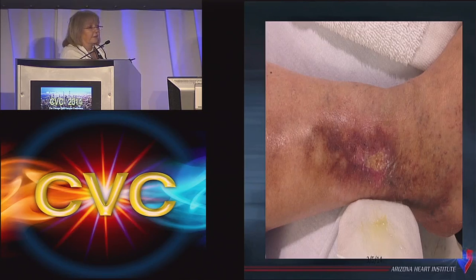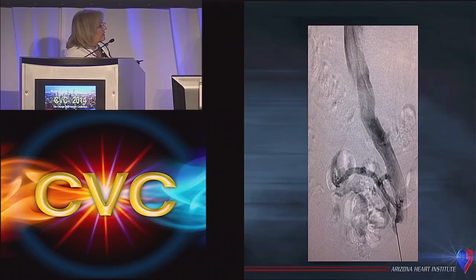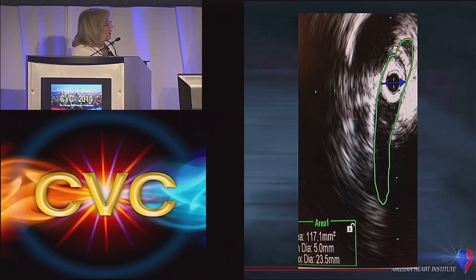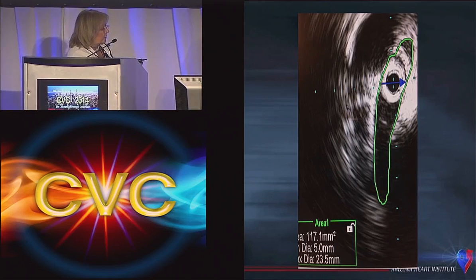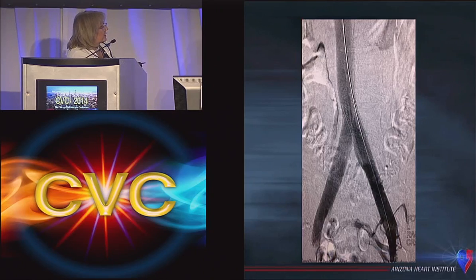Now, interestingly enough, this is the patient who had an ulcer because there was a May-Thurner condition, and she presented with this ulcer, and no one had ever picked up on the fact that she had an iliac compression. Now, grant you, this doesn't look very bad here. The flow's going through. There's a little bit of reflux, transsacral pelvic area, but her imaging showed that on IVUS, using the 8 French device, it's quite narrow, 5 millimeters, and you can do the millimeter squared diminishment from the normal vessel, and you can see that's very significant. And here's with a stent.